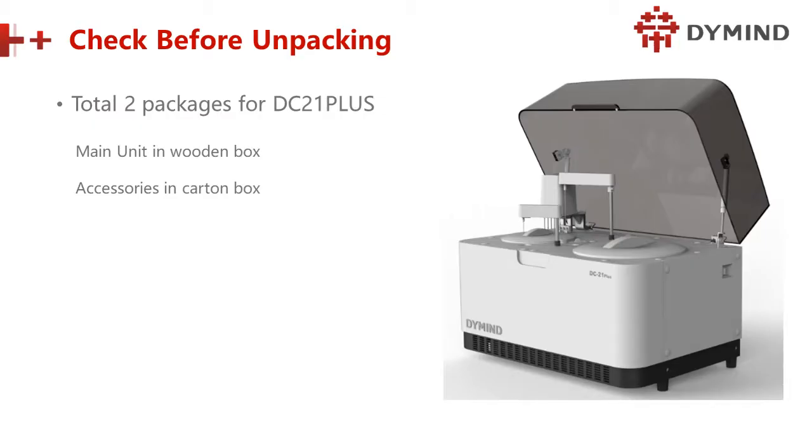So what to do before unpacking? As we know, there are two boxes. When you receive one unit of machine from Dymind, you will find two packages. One is a wooden box, and one is a carton box. The main unit is in the wooden box, and the accessories are in the carton box.